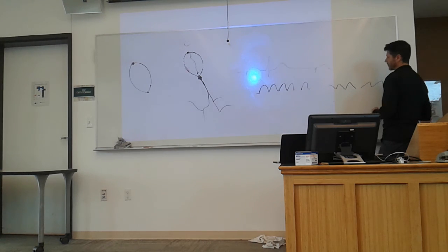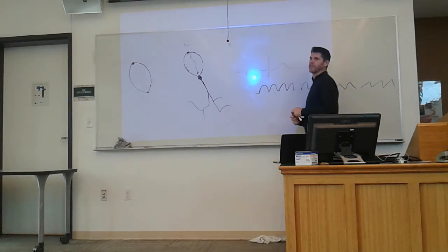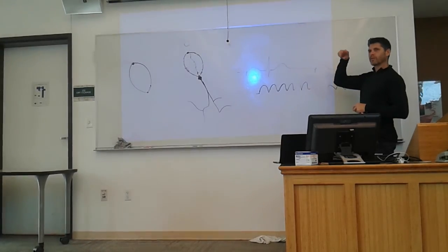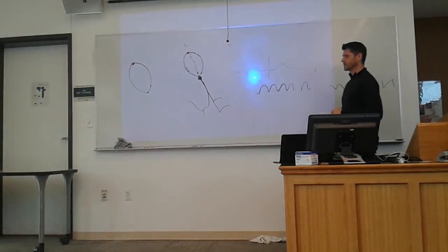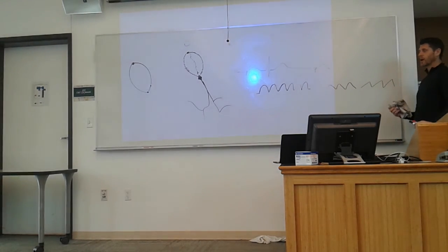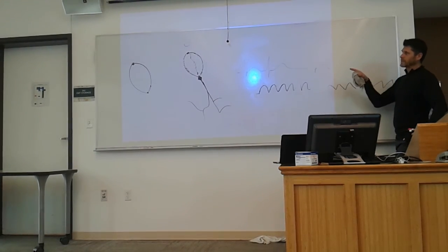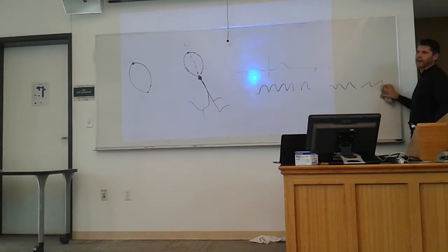fast dip, depends on where that damage is in the heart, and therefore what shape that loop is actually taking, whether it's clockwise, counterclockwise, anterior to posterior, posterior to anterior. So the shape of it will be dependent, and we will see some specific shapes that I'm not going to hold you to. We do see some specific shapes where we see some common problems for this to occur. But the shape is completely dependent, and whether it's upright or downward completely depends on where that damage is and whether or not it's taking a counterclockwise or clockwise circuit, which you will not have to determine.